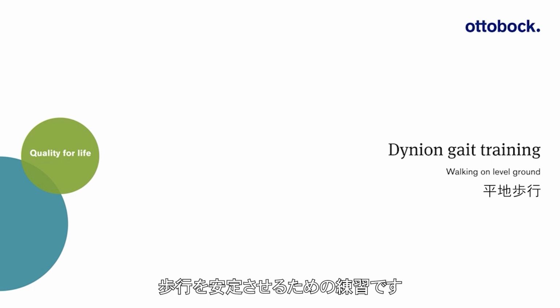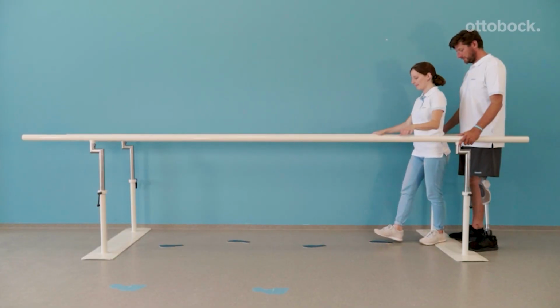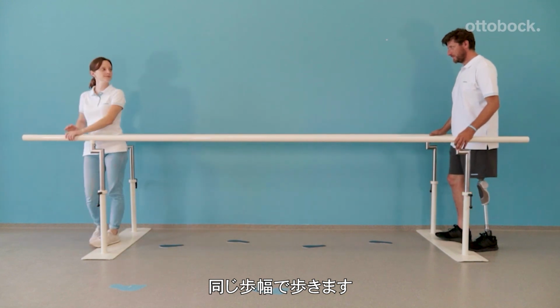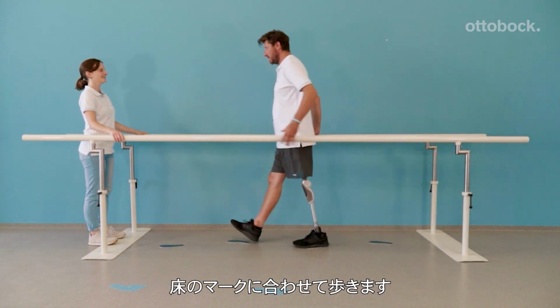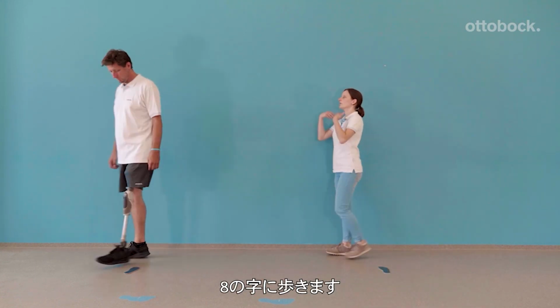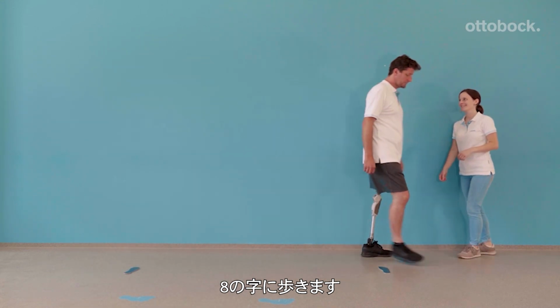To refine walking techniques, the following exercises can be used and adapted. Shown here is a technique to learn how to walk with an appropriate step length. In this exercise, our model walks around 2 markers in the form of an 8, which help him learn proper stance release.